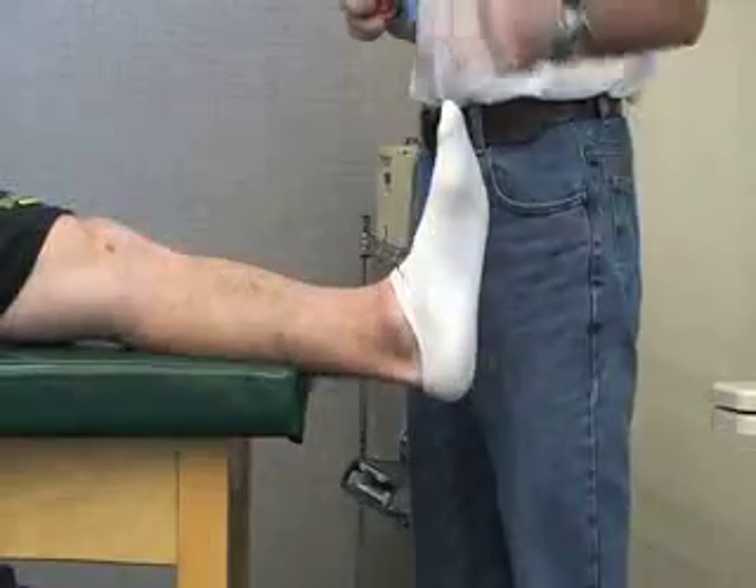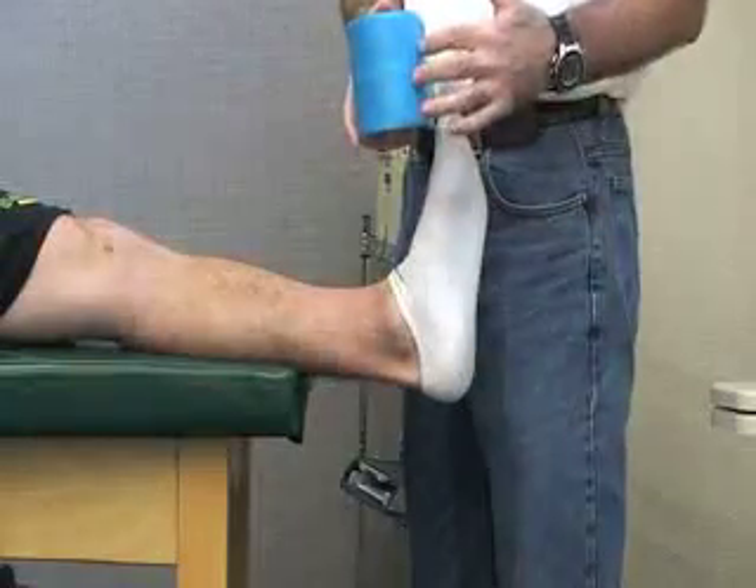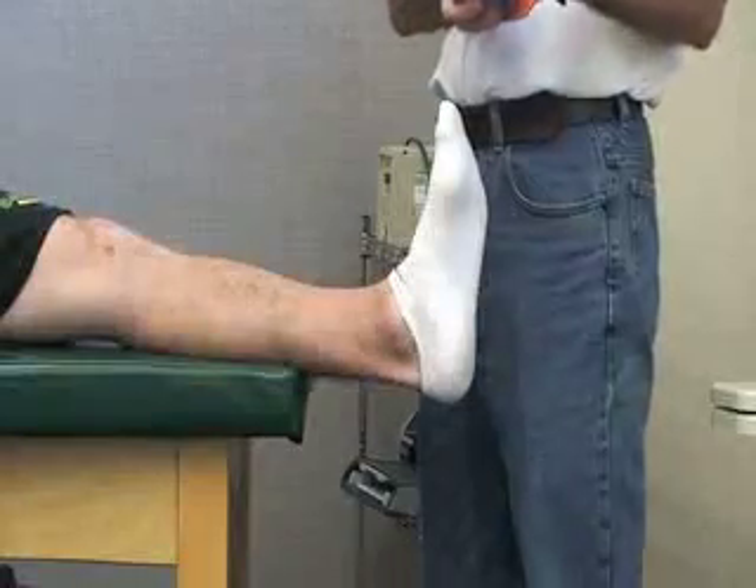Next we're going to be doing a figure-8 splinting using a 36-inch SAM splint to immobilize it. This is a rigid splint.